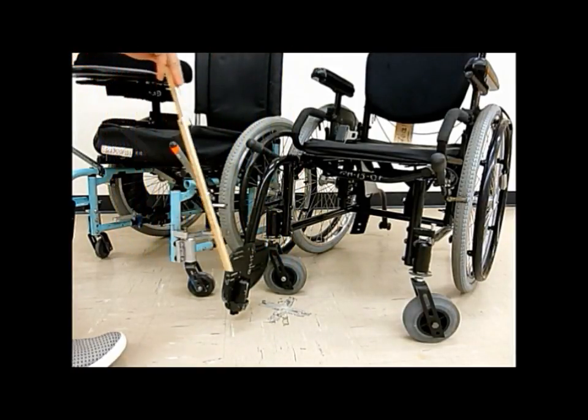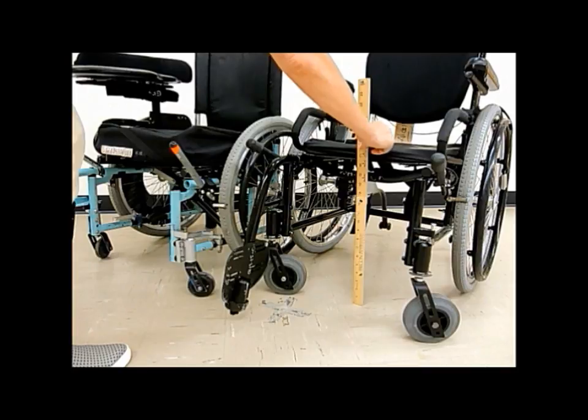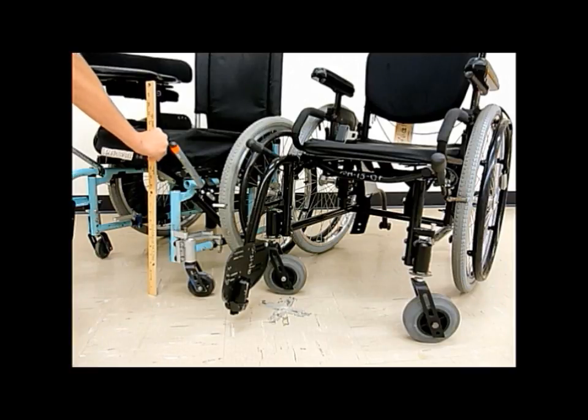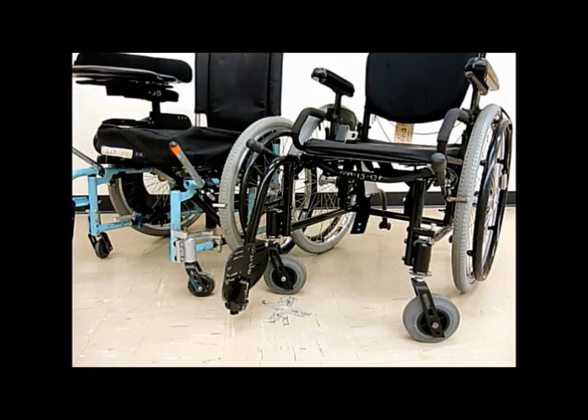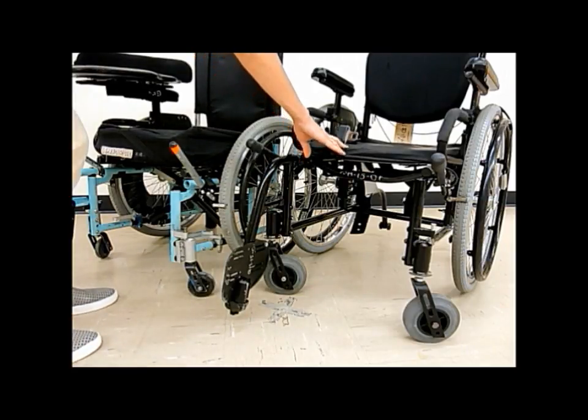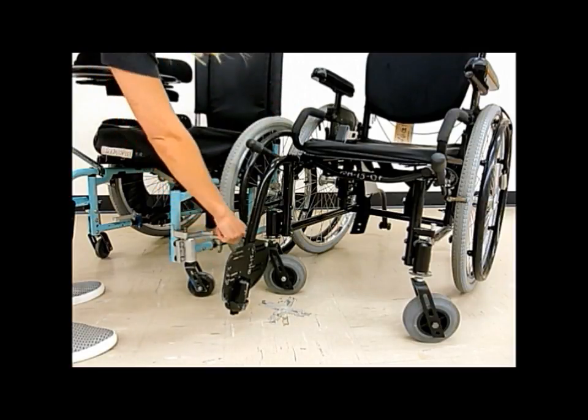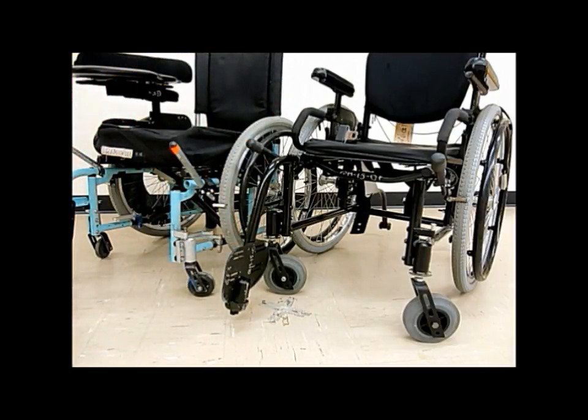Both of these wheelchairs have the same seat to floor height. Here and here. This cushion would be pushed down just a little bit, but they're the same height. So a seat to floor height can be achieved in a number of different ways, and some make it easier to wheel than others. For example, a low profile cushion and or a dropped seat, they lower the seat to floor measurement and can allow for bigger wheels and casters. So you can see that these wheels and casters are much bigger than these wheels and casters. And bigger wheels make wheeling a lot easier versus only using small wheels and casters to keep the seat low, which will make it harder to wheel.